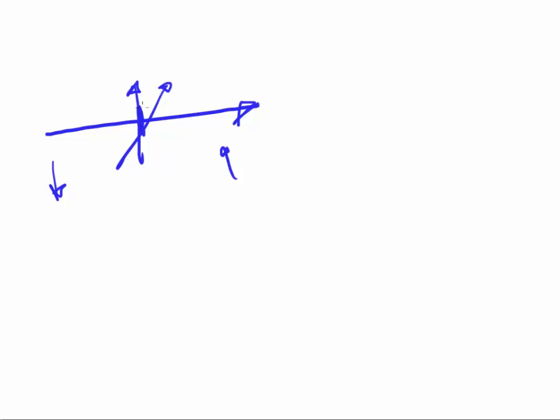So if we only want to image right in the center of the magnet, we can add this field, this difference in field strength, so that the protons along one side and the other side do not resonate. That allows us to select which protons in space we are looking at. So these changing magnetic fields in all three axes can be used to discern between the information, say, at one point and another inside the magnet, in similar fashion to what we have shown along the main field.